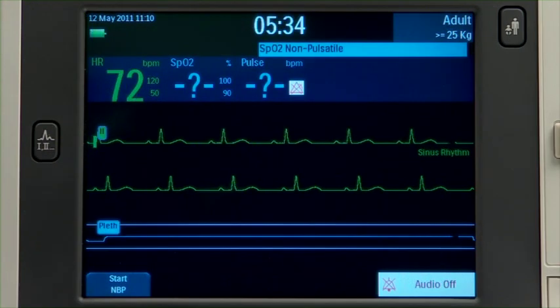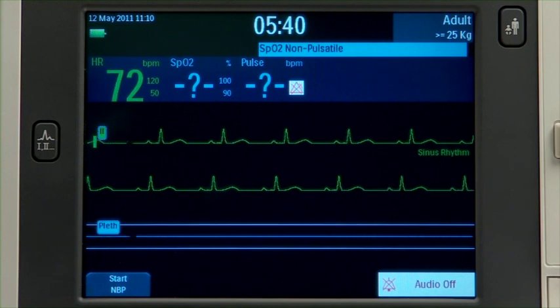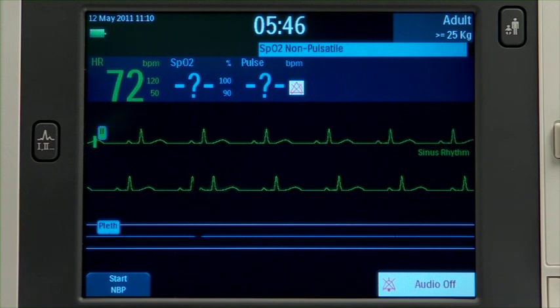Low priority alarms usually indicate a device problem or error condition, such as an SPO2 non-pulsatile message. They appear with a cyan background.